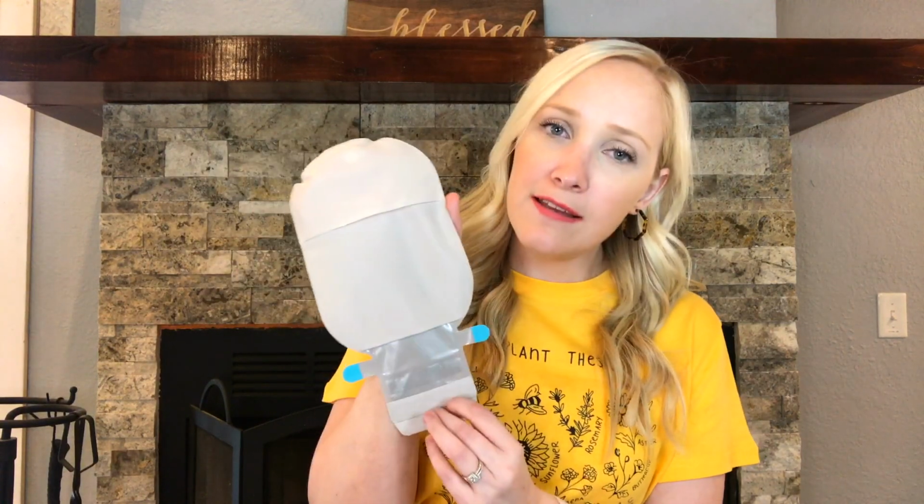And all different brands make all different kinds. That's why I've got 2 different brands here. This can be applied across the board. They make drainable. They make some that are Velcro type material. They make some that have a clip at the end that you can roll it up and then clip it. All kinds of options out there. So I wish that she would have recommended something like this, because I was emptying so frequently.